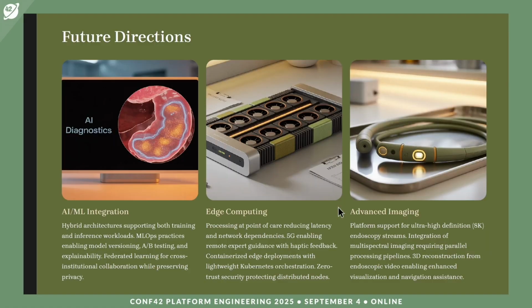Future directions: AI and ML integration, edge computing, advanced imaging for high definition and ultra high definition 8K, and 3D reconstruction from endoscopic video enabling enhanced visualization and navigation assistance.